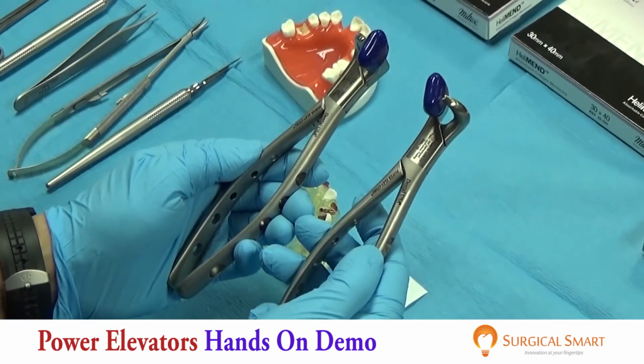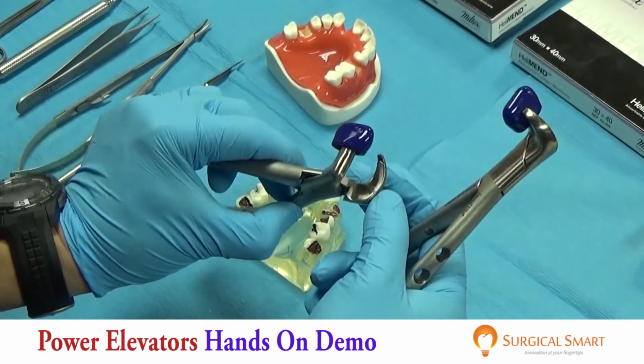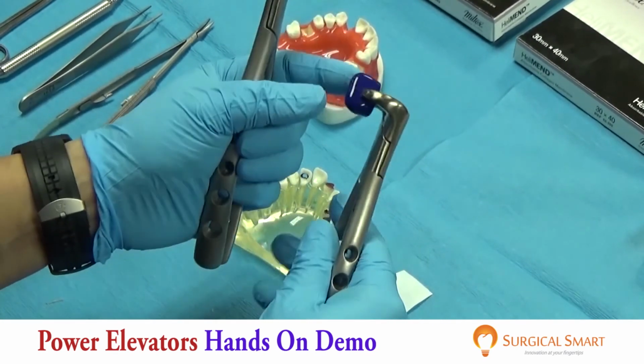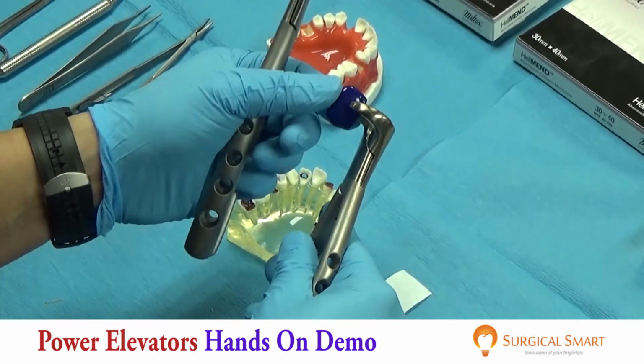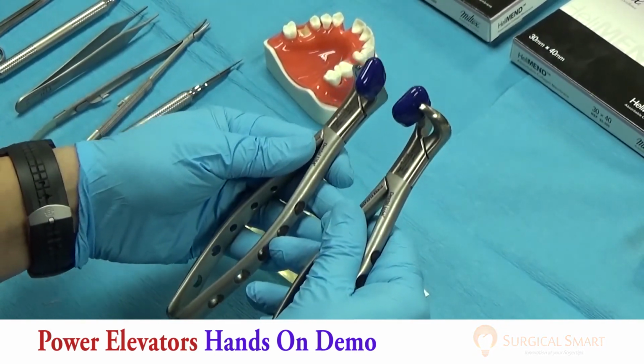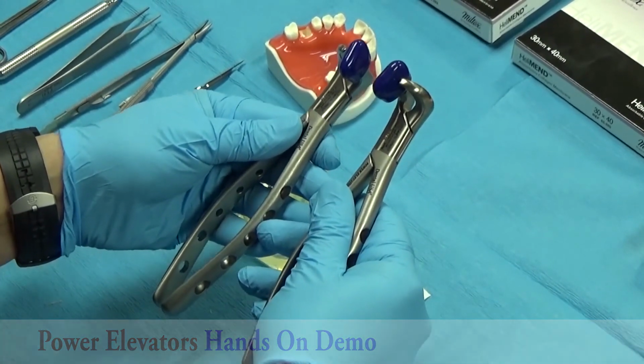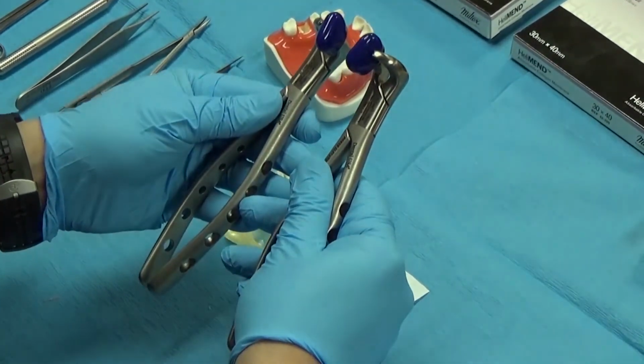These are called power elevators, and these bumpers can be re-sterilized. Okay, and of course they sell you more bumpers so you can replace it. And these work very well. These are what I would consider the workhorses of extractions. And it's just 2 of these, and you can take out any tooth in the mouth.